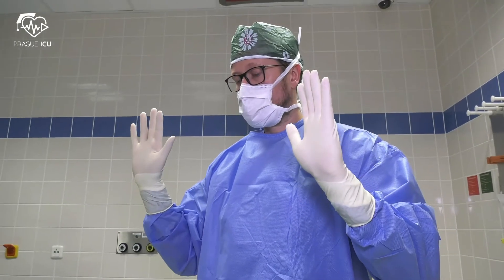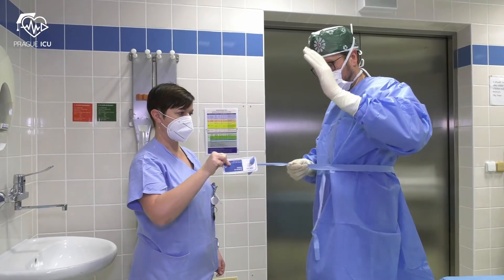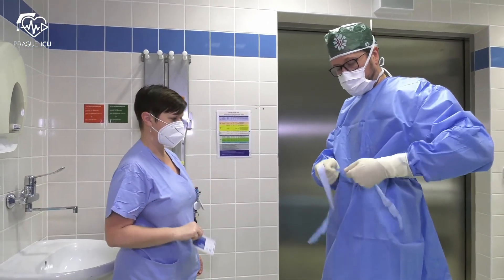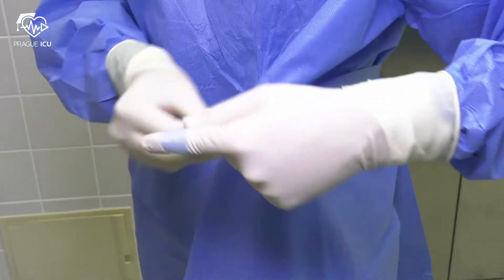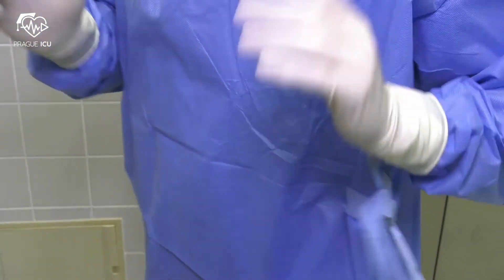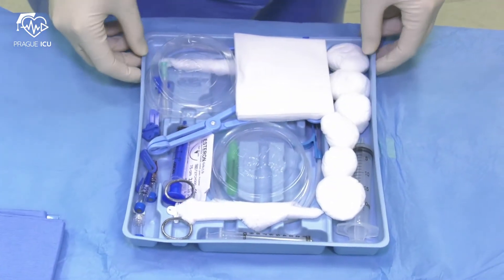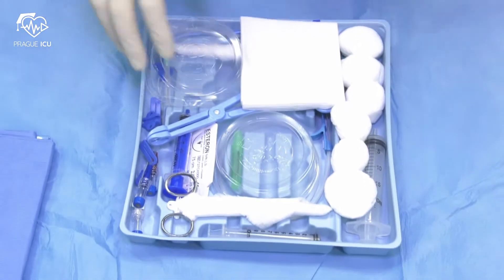Now when the gloves are on, you're ready to complete the gown tie with assistance of the circulator. Now you can prepare your instruments appropriately. I always do it in a clockwise fashion.